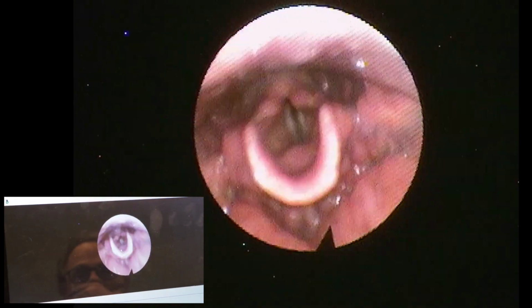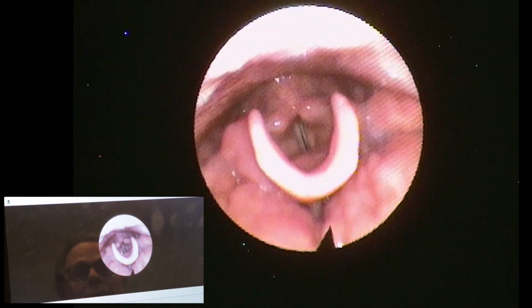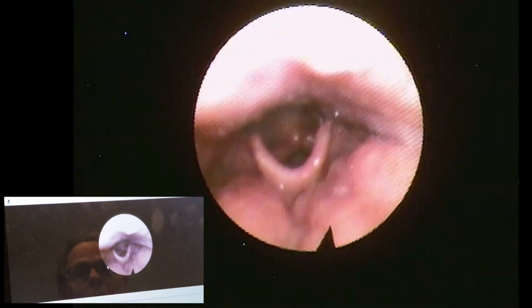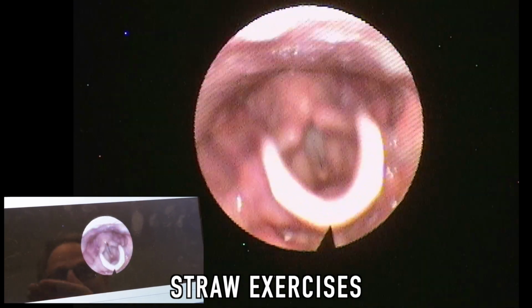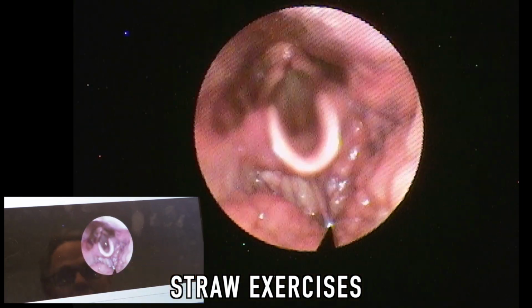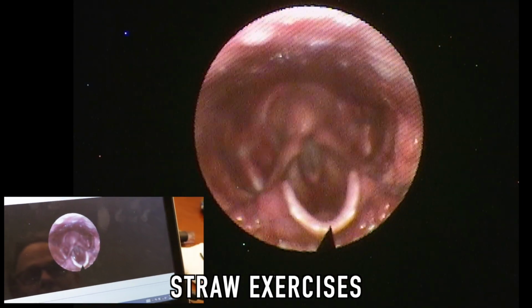This is really, quite honestly, I've never seen anybody yet, not that I'm the end all, who narrows that epiglottis like that, the whole epilaryngeal tube. So you see your larynx elevate like that, and then the arytenoids come in. And then the second time I tried to consciously keep a little more in to keep it lower.